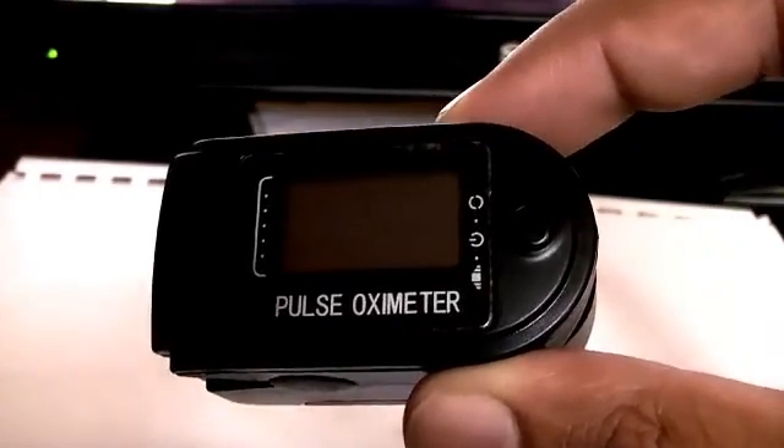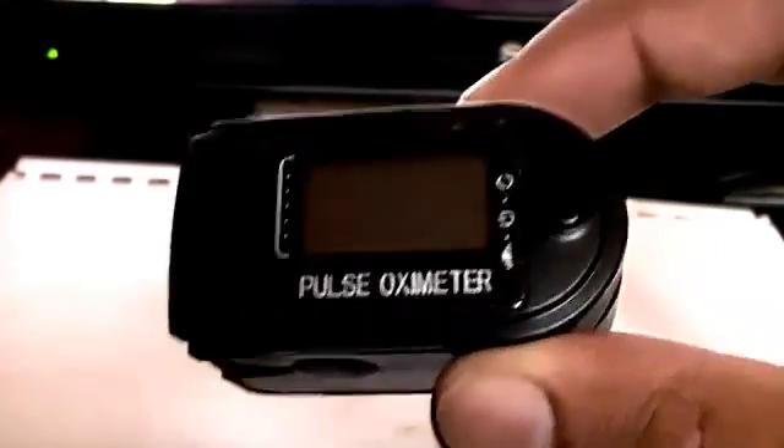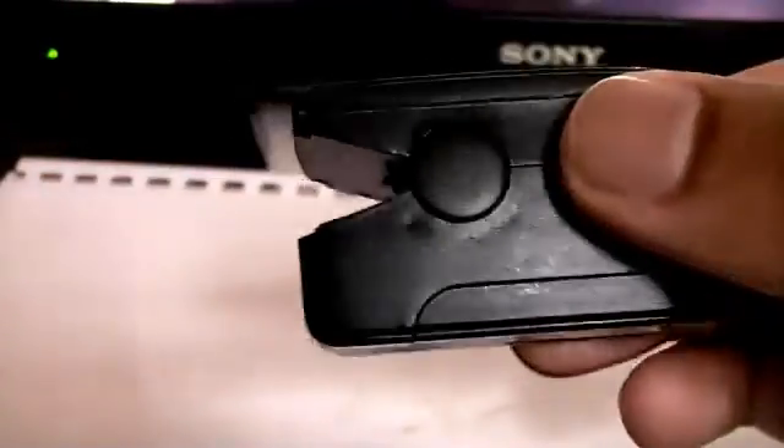And if you let it for some seconds, it will just switch off by itself, which is kind of cool to use. Alright, goodbye.